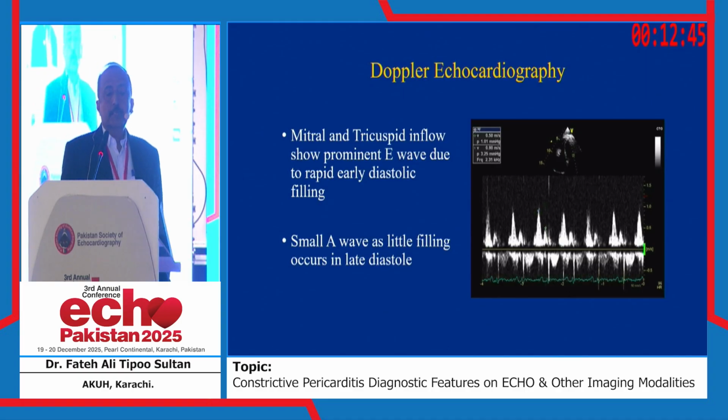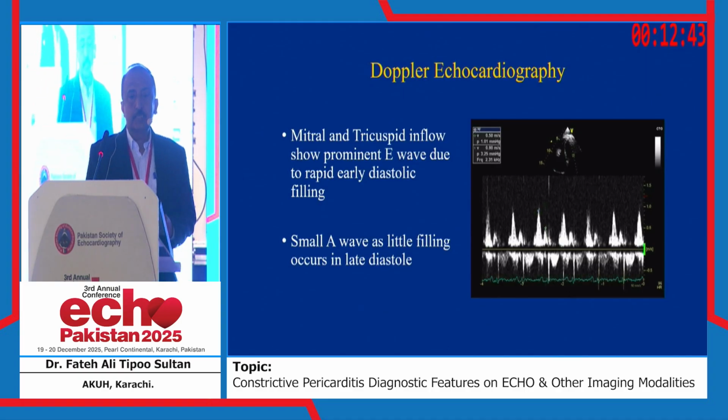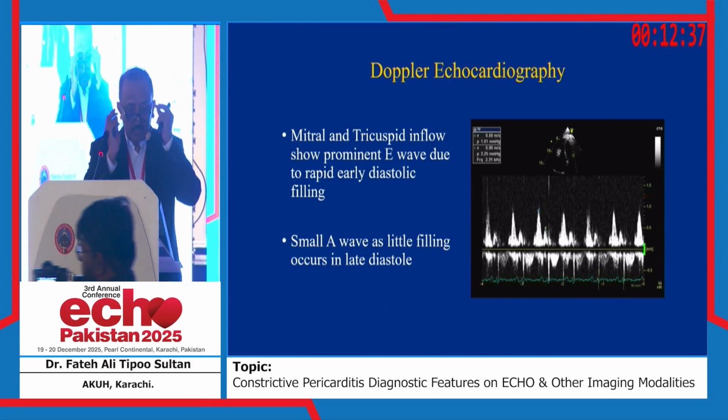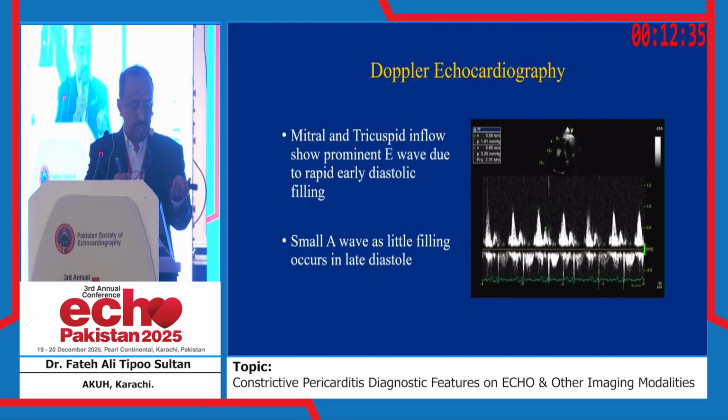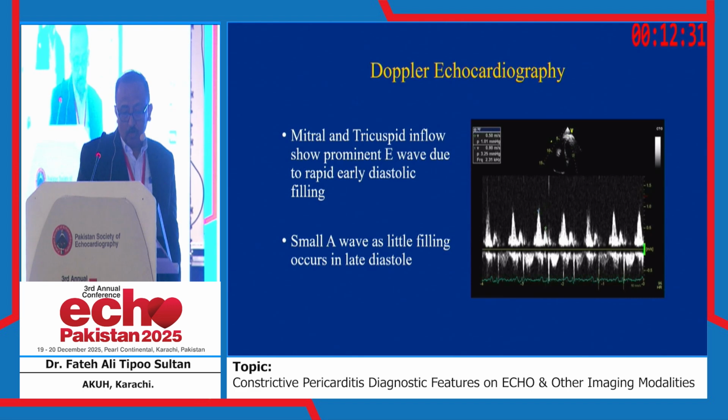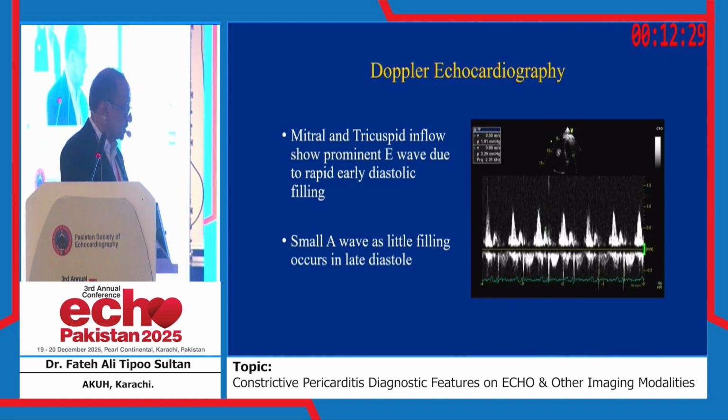Then come to the Doppler examination. The Doppler examination of the mitral inflow and tricuspid inflow is important, and again there will be increased E wave. E wave velocity would be increased, and there will be small A wave on mitral inflow as well as the tricuspid inflow.